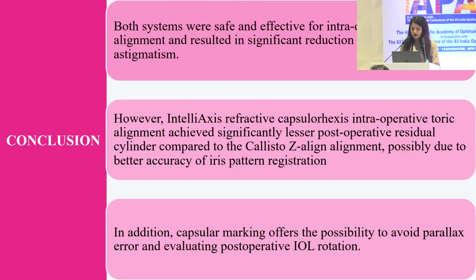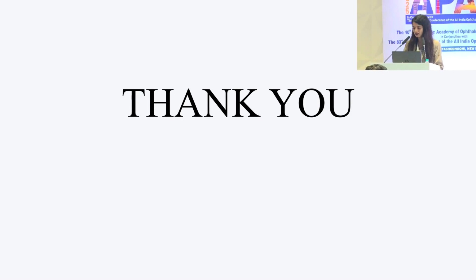In addition, capsular marking offers the possibility to avoid parallax error and to evaluate post-op IOL rotation. These are my references. Thank you.